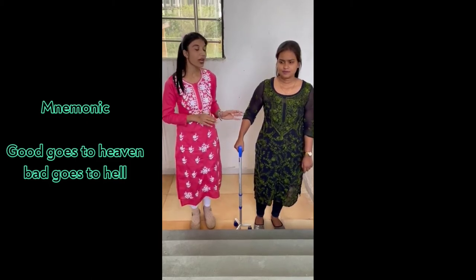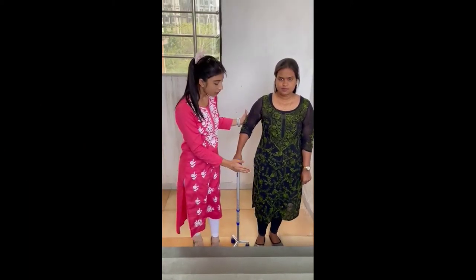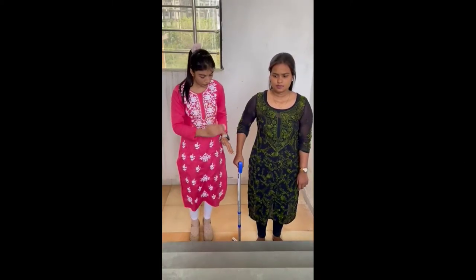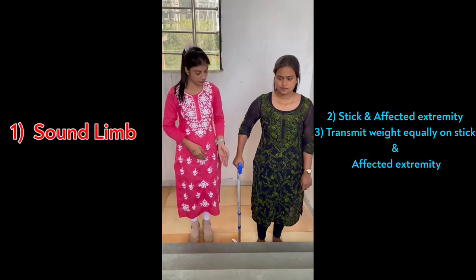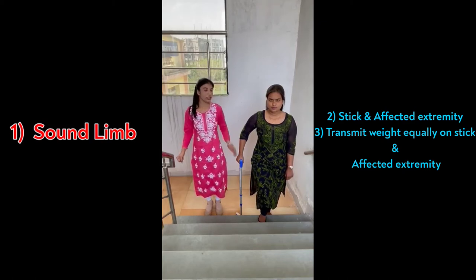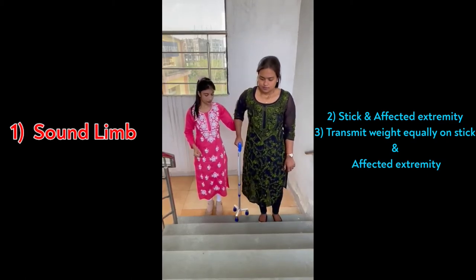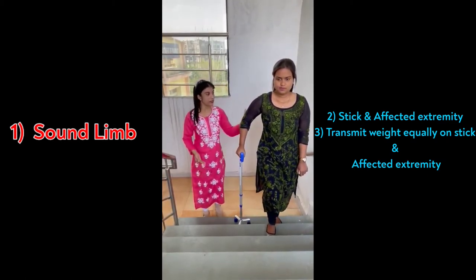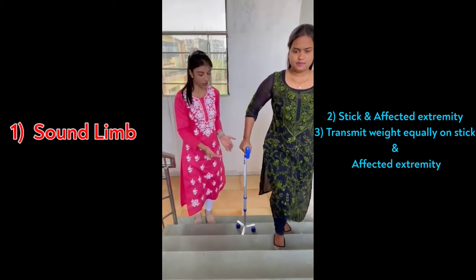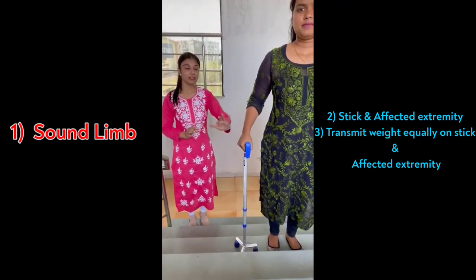Now I am showing you how to climb stairs with the stick. Keep your patient near to the stair. Keep your non-affected extremity first — that is the right extremity. Now transmit your weight on the stick and on the affected side, then move forward up the stair. Again, non-affected side, transmit your weight and stair up. This is the stair climbing with the stick.